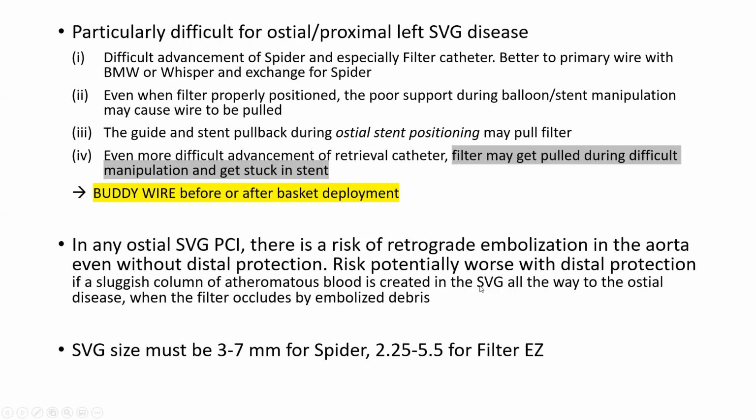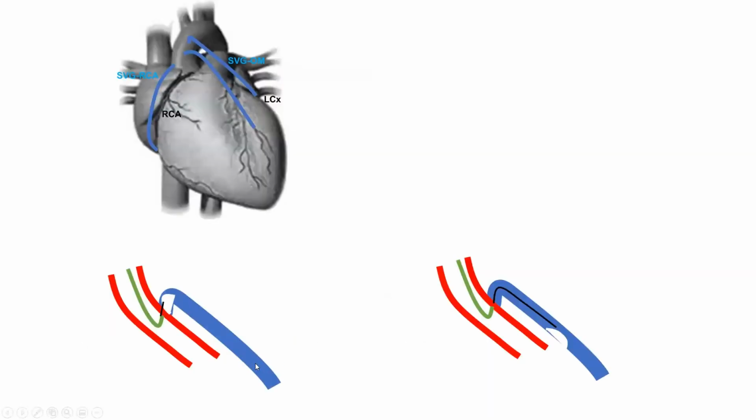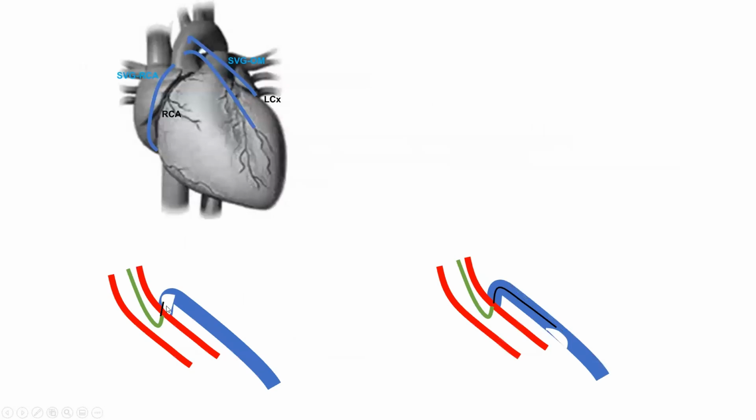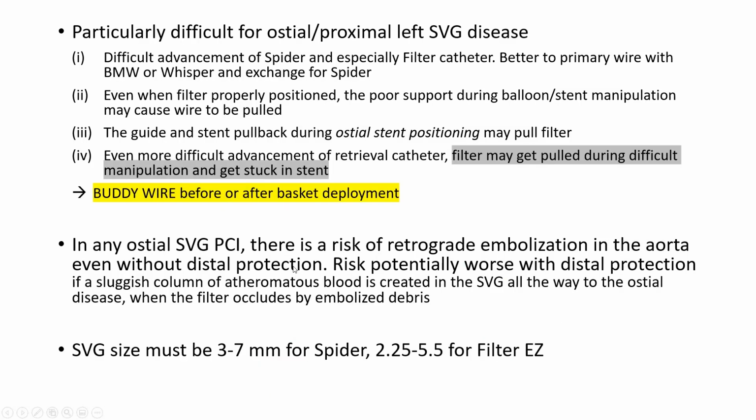The risk is potentially worse if you have distal protection here, with a sluggish column of atheromatous blood created in the vein graft all the way to the ostial disease, which is aggravated when the filter occludes by embolized debris. So the filter may cause a sluggish column of blood, or aggravate the potential for it, and aggravate the potential for retrograde embolization, particularly when the disease and the heavy atheroma is ostial. And that's why ostial disease was excluded from those trials.